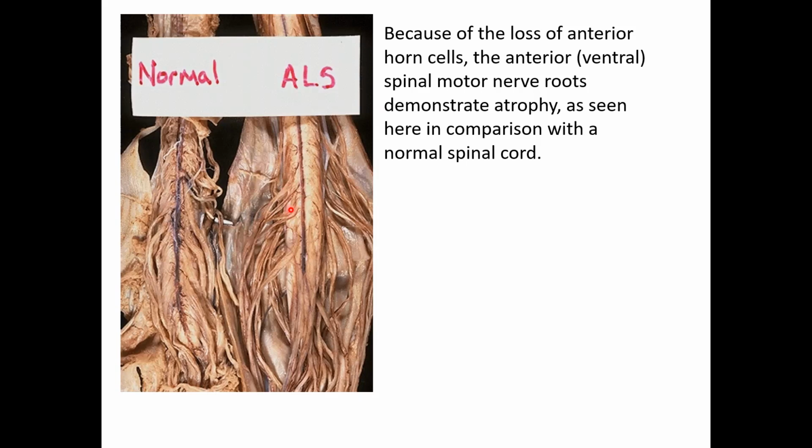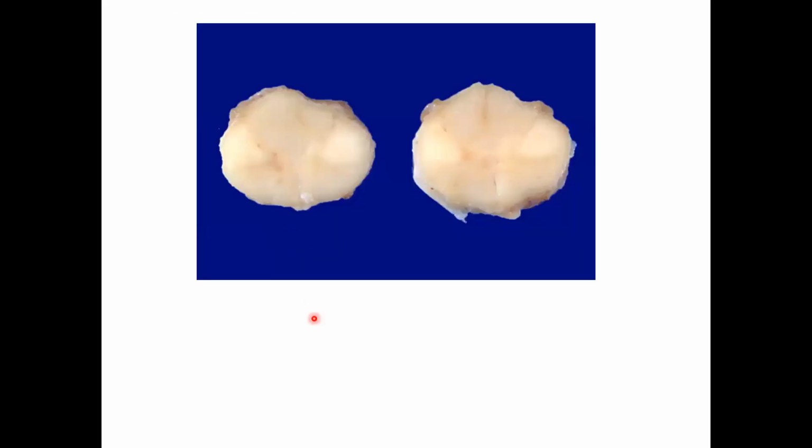بصير في عندهم paralysis، يعني this disease is progressive، ببلش lower limb paralysis بعدين upper limb paralysis بعدين if it affects the respiratory muscles they might die because they might stop breathing. Okay, so the affected areas اللي صاروا sclerotic are these areas شايفينهم. Sclerotic صار شوي لونهم white in color, and these are the affected areas by amyotrophic lateral sclerosis.